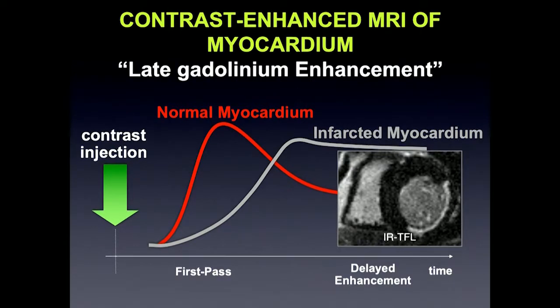And you see subendocardial enhancement here on these late gadolinium enhancements shown in the inferolateral wall. And the pulse sequence that's generally used is a segmented inversion recovery turboflash. In most instances now, phase-sensitive inversion recovery reconstruction is used. So this obviates the need for any particular TI scout or timing mechanism for measuring the inversion time.